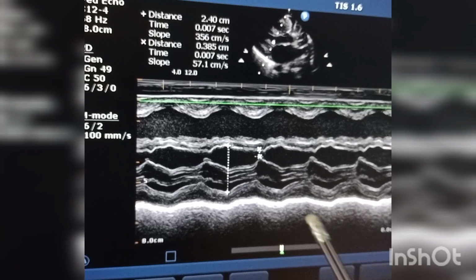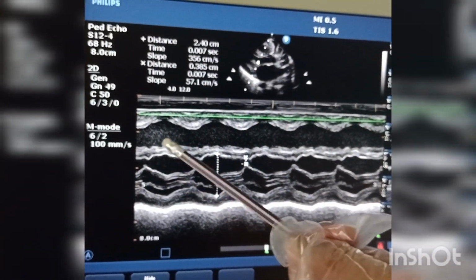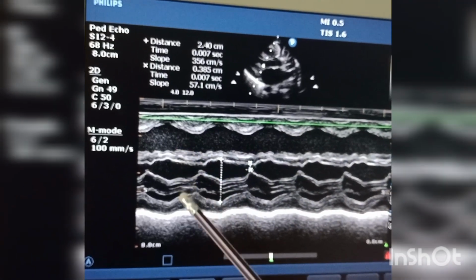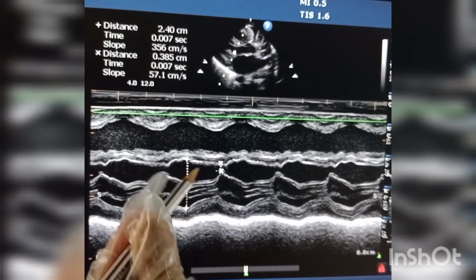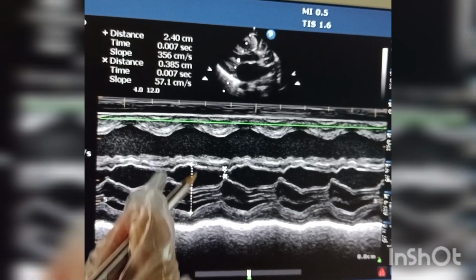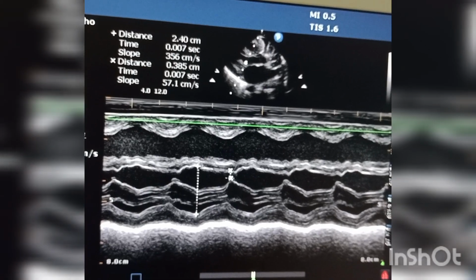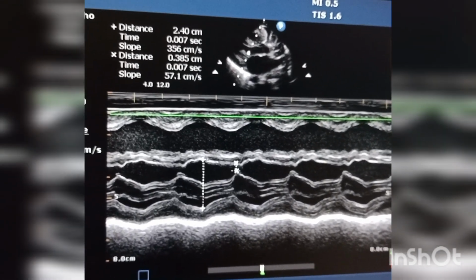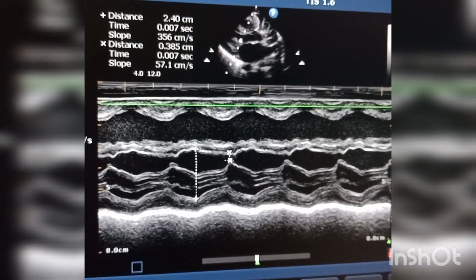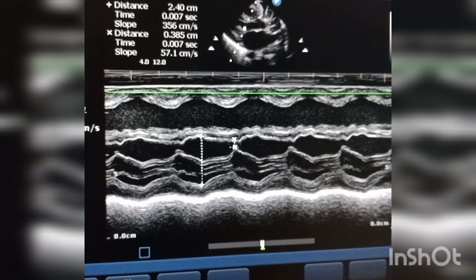You get this image, and what you see here is the right ventricle, the interventricular septum, and this is the left ventricle. You can see the mitral valve here. If you look in diastole, the left ventricular diameter is big. It means the LVEDD is increased. So this also indicates that there's too much blood entering into the left heart, again one of the indicators for increased pulmonary circulation.